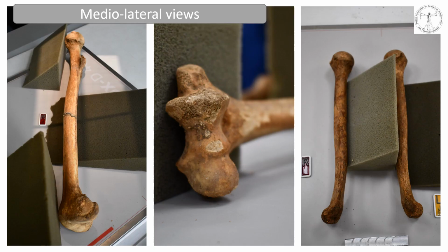It took so much time, and that really was one of the limiting factors of our speed. Here are some examples of using the sponges to perform a medial lateral view. The femur on the left, the distal end of the humerus in the middle, and then the humeri on the right hand side. You can see that I've got the markers, left and right, corresponding to whether it's a left humerus or right humerus.